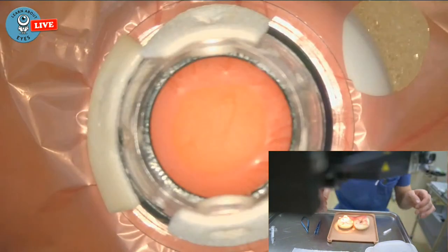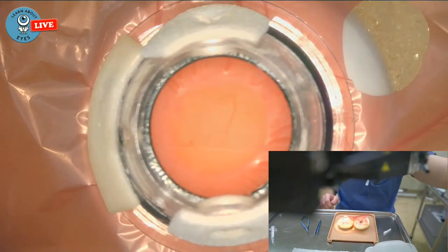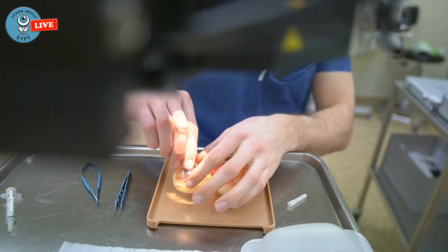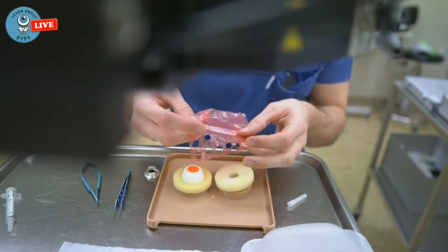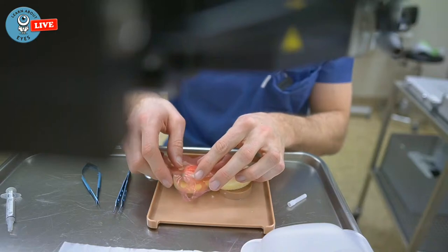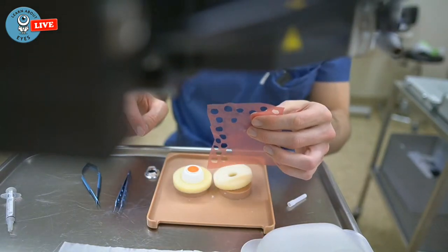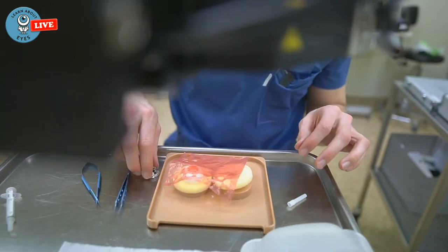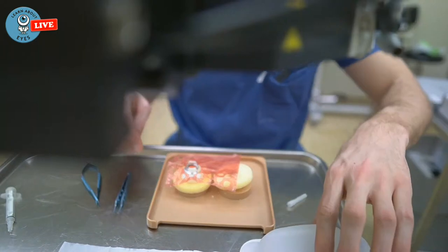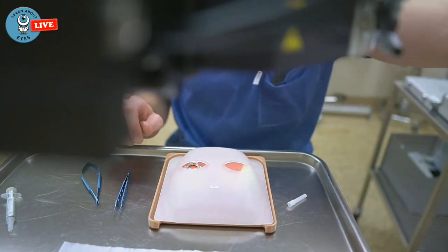So, what do we do now? We switch back to this view, and we're gonna change the foil again. Just put it so you can see it. I've already used this the last time quite a bit, but then you can just use it for quite a lot of time with not a lot of foil, so that should be fine. So let's get back to this view.